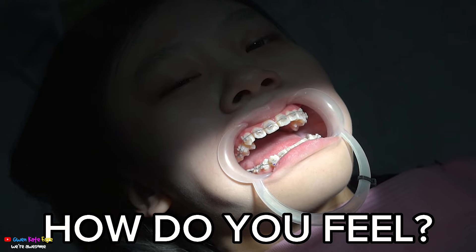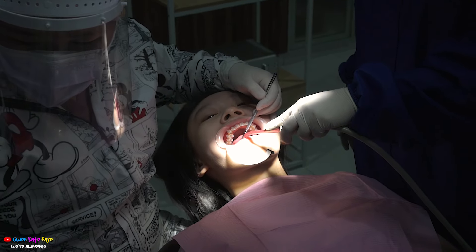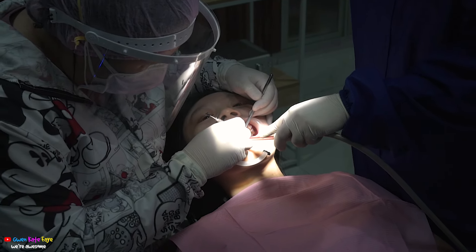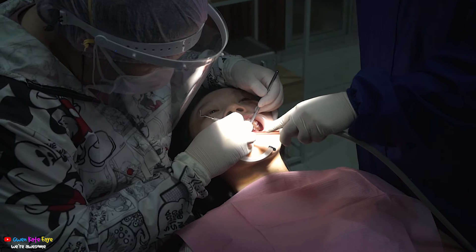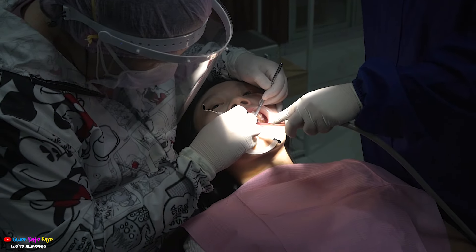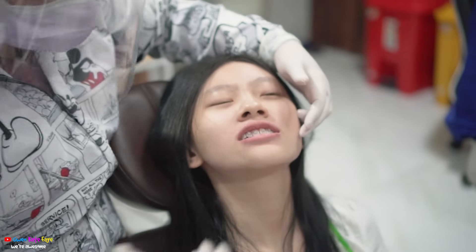What do you feel? Would you say it's okay with the keys? No. Alright, so it's okay with my teeth.